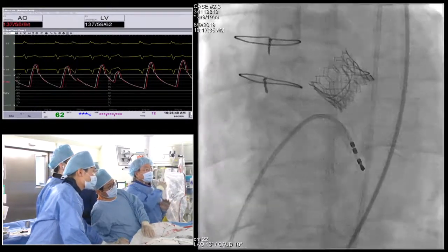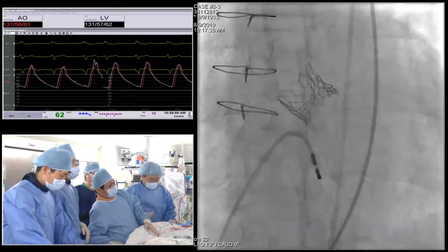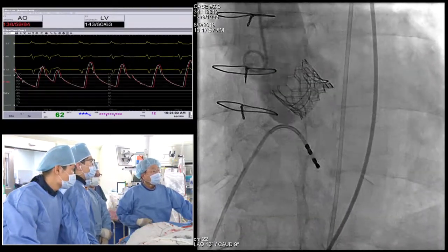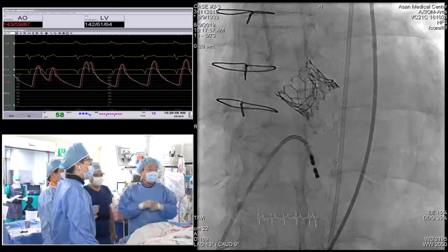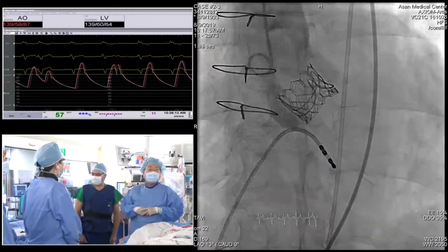There you go. So you can see very nicely. You're right aligned on the... I want to check one more. Do a little cine, maybe. So you're perfectly aligned there at the bottom. Angiogram here, and then I want to finish this procedure. That's perfectly aligned, right on. I want to wait a little bit more. It's very good. Compensated there. All right, thank you. Excellent.